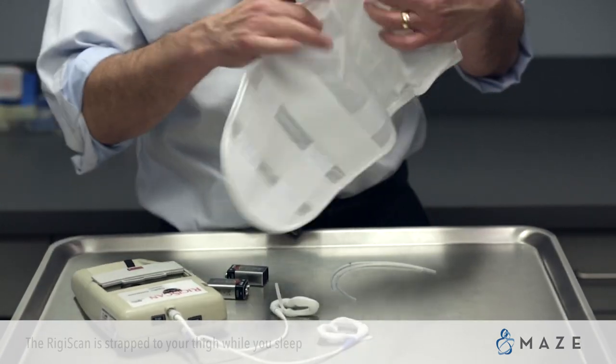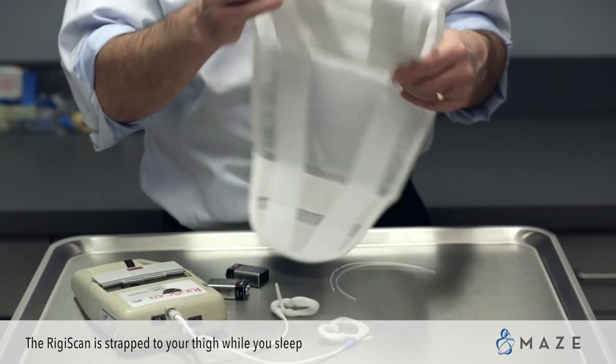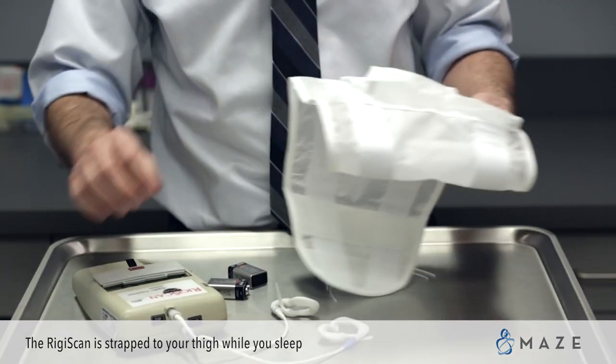The next step is to put the strap around your thigh, because the device is going to fit into the strap.